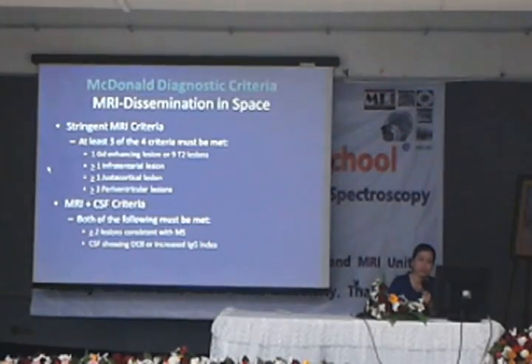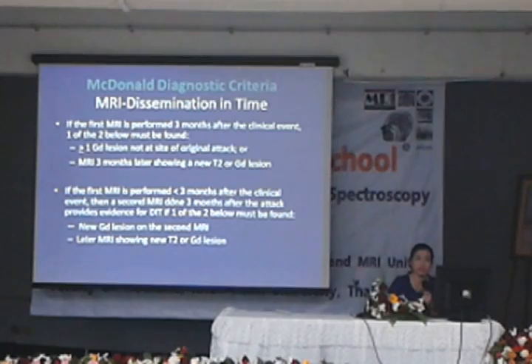For the diagnosis, it's not easy. The clinicians came up with diagnostic criteria where we have to look for the right regions in the brain and count the regions and try to zone the regions in the juxtacortical or periventricular area in the white matter. That's not easy to make a diagnosis. Then MRI has a very important role in making the diagnosis in this case.